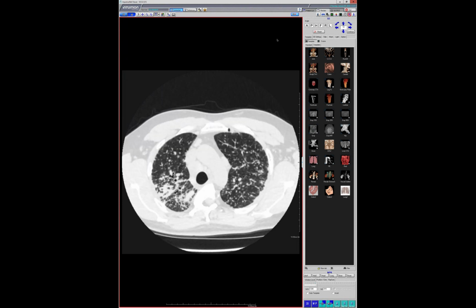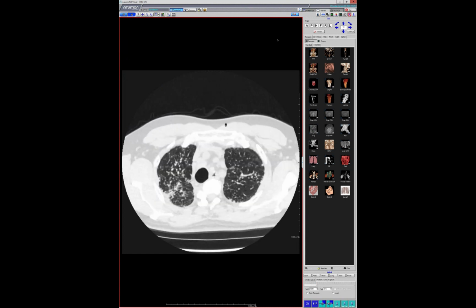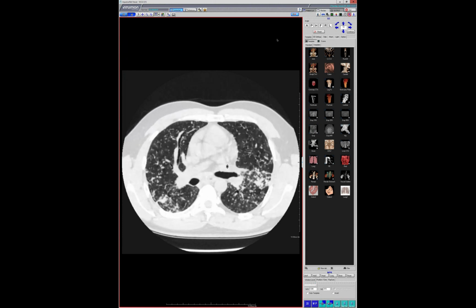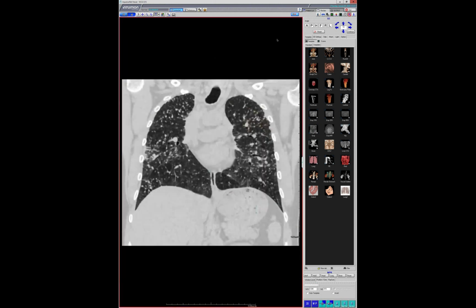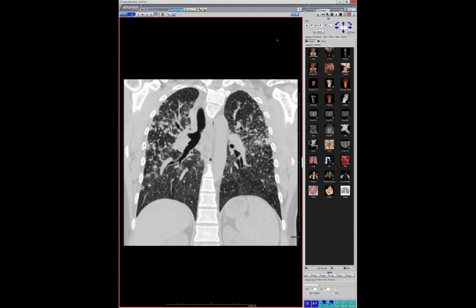going to progressive massive fibrosis in the right upper lobe, and extensive nodularity. Some of it's more random. There is clearly a perilymphatic component, but some of these are outside that distribution. And he is very young. I think he's 40. And he is a gentleman who works on fabrication of granite and marble and quartz countertops. And this is his stone.